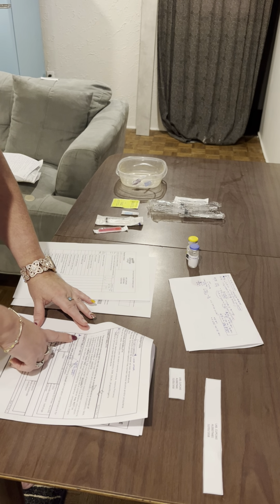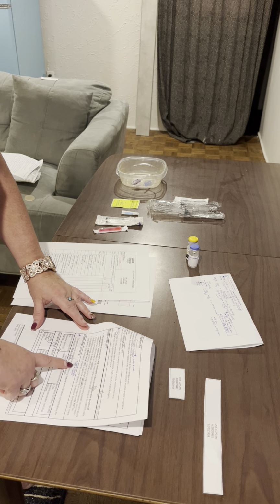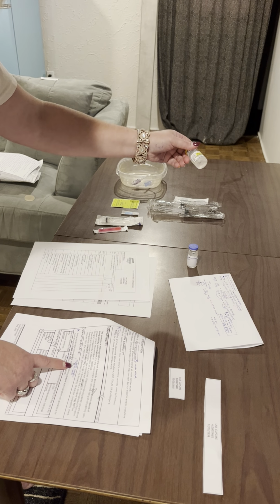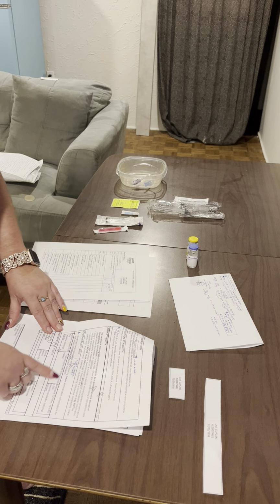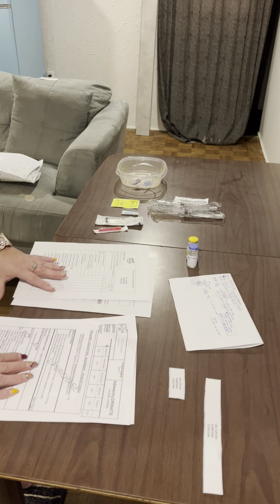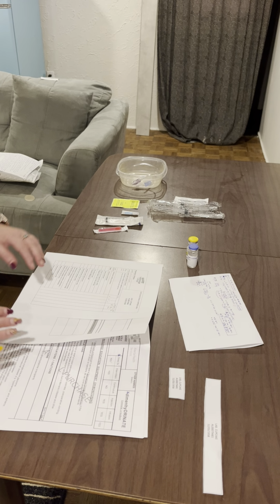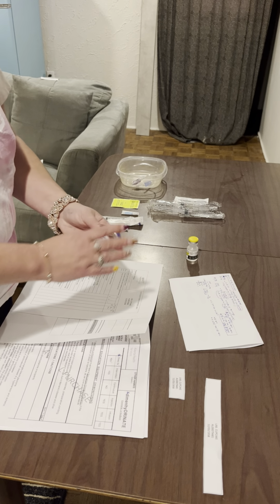And we're looking at the compatibility site, and this is basically compatible with normal saline. So again, we have our normal saline here, and we're going to use this as our diluent for dilution. So we should be good there. And it's compatible with the Y site. Okay, so we've checked all of those 3 things. So the next thing we're going to do is our first medication check.